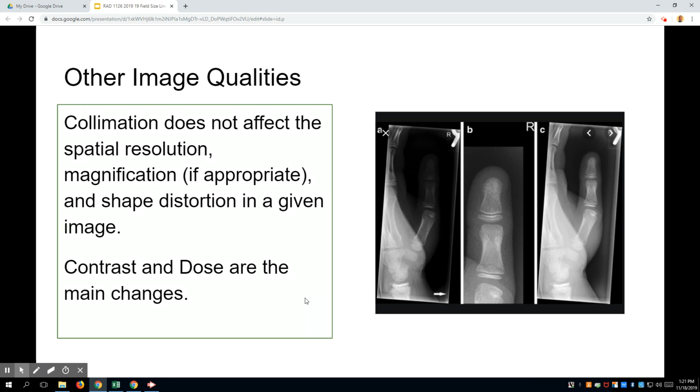Some of it's changing because they're creating different algorithms. But when CR first came out, when DR first came out, well, DR is still the same, it was 1 exposure per view, per image receptor. I remember doing 3 views of a wrist quite commonly in 3 little squares of collimation. And I used to feel good when they all had their own 4 borders of collimation around them. None of them were overlapping.